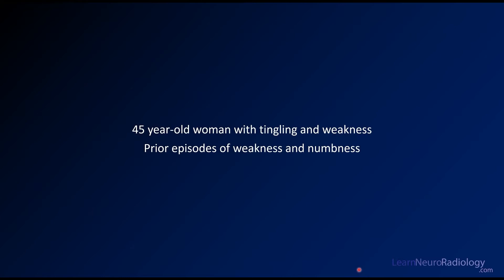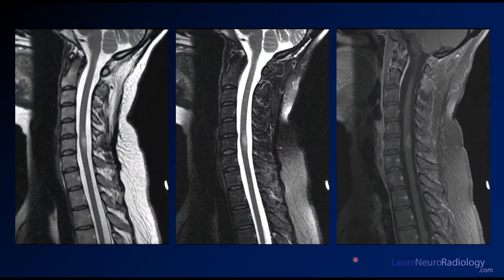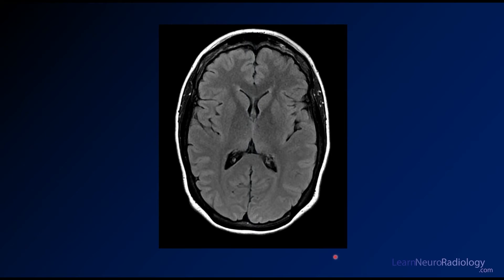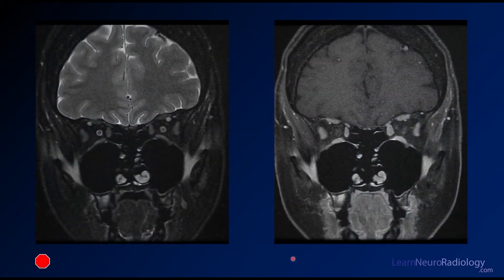Moving on to our next case — a 45-year-old woman with tingling and weakness, prior episodes of weakness and numbness, so a very similar history to what we already saw. We have some images from the spine: a cervical spine T2, a T2 fat-sat or STIR image, and a post-contrast image with fat saturation. Here we have axial images through the central portion. Maybe you see something a little funny about the spinal cord. There's also an image from the brain — a FLAIR image that looks pretty normal. And here are some images through the orbits where you can get a look at the optic nerves.